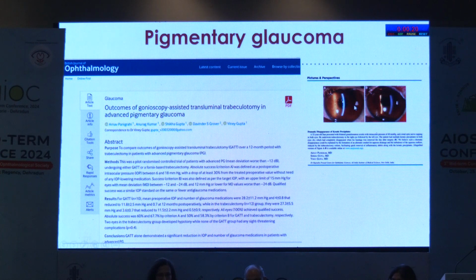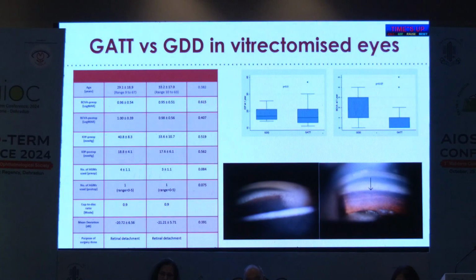This was a case report which has been recently published in Ophthalmology, where we saw that GAT surgery also helps. This is a patient with severe KPs and pigments in the AC with pigmentary glaucoma. And this is the first day post-op. Because we are de-roofing the Schlemm's canal, GAT also helps in the outflow of the pigments through this route and leads to miraculous disappearance of the keratic precipitates. And of course, it will also help in lowering of the IOP in the post-operative period. This series we have already compiled, that GAT can also be used.